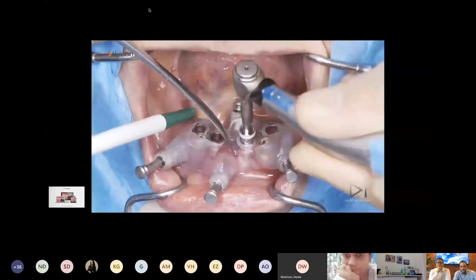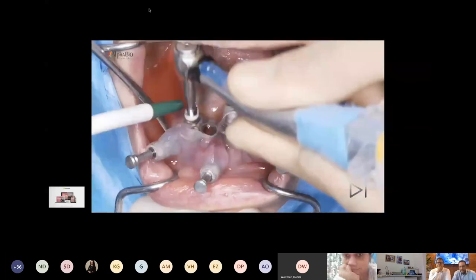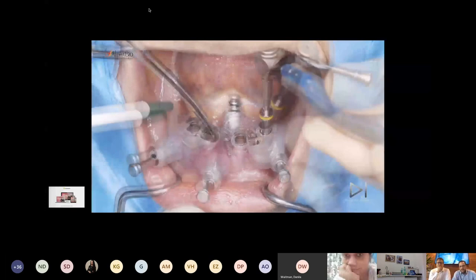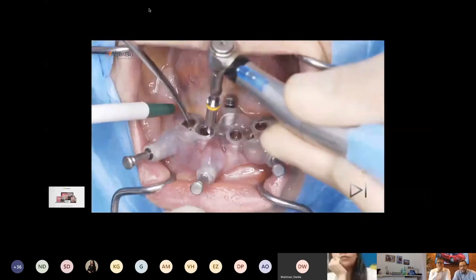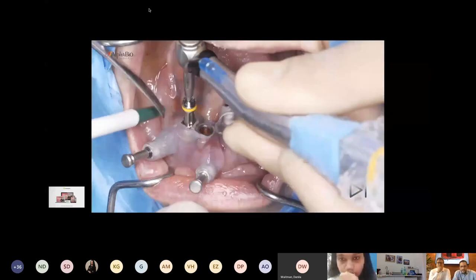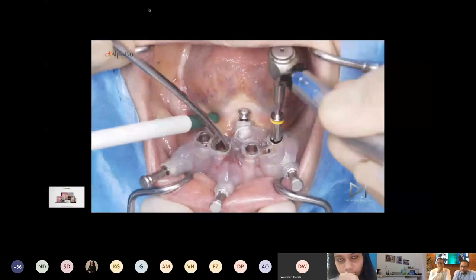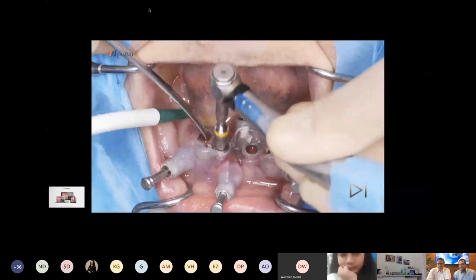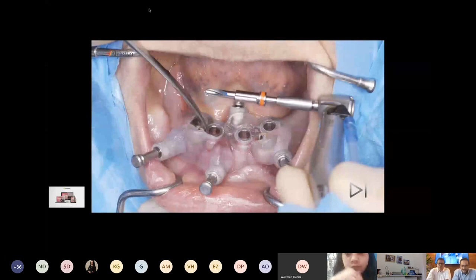Then after the eight millimeter, we increase the length, not the diameter, to the final length of the implant. Most of the time, we can overextend in length the preparation of the first drill. Then we drill the 2.4, the yellow. It's very easy to find the yellow color in the kit. And so we can drill very fast the first drills, the white one, the red and the yellow. Thanks to this kit, when we manage the surgery, we start to speak about colors, not the diameters of the drills.